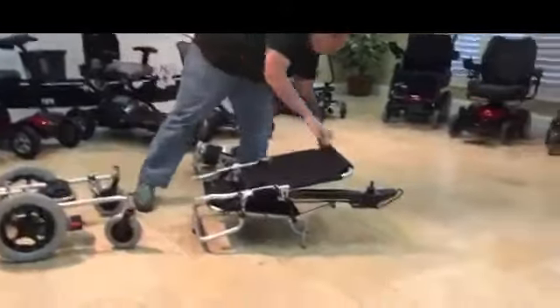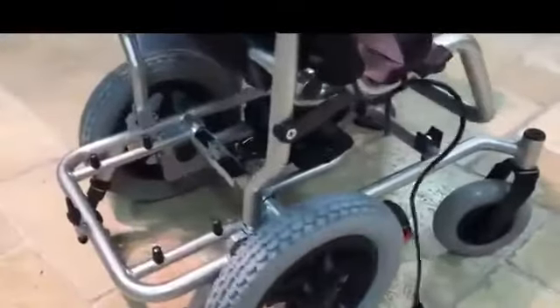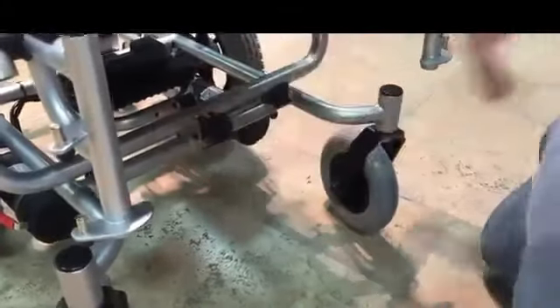And now we put the chair together. Take the top portion, we're going to fold it out. We're going to lift it and guide it into the back guides. Make sure they're in place. We're going to pull the pin so it seats — make sure that's locked in.